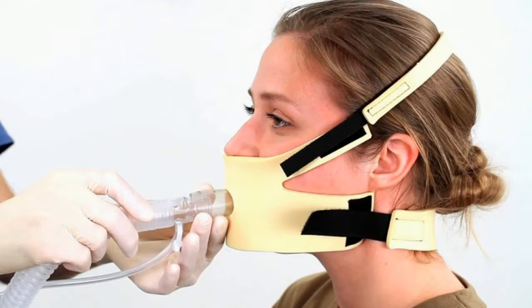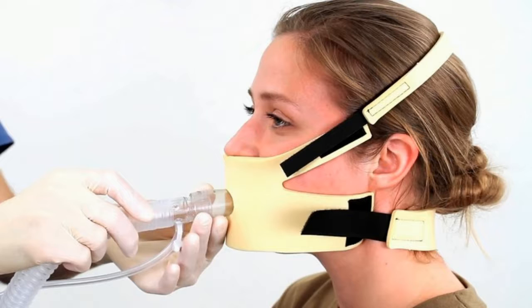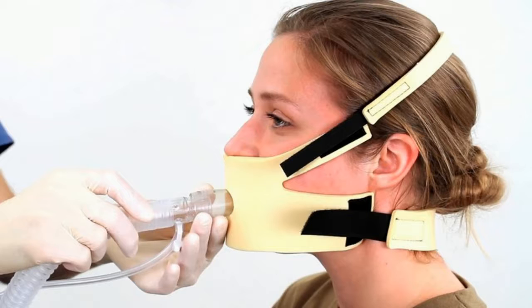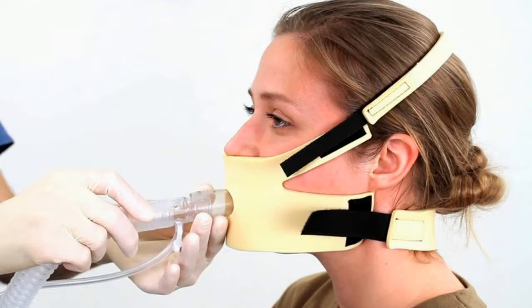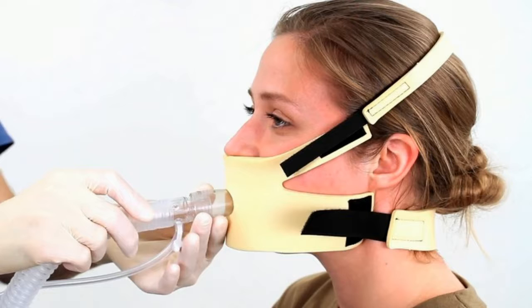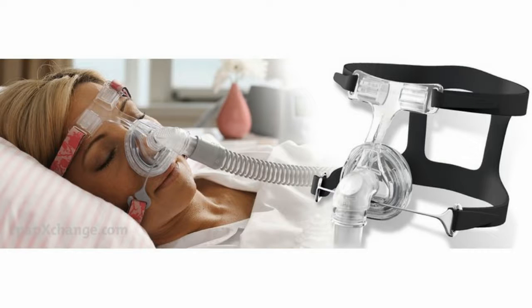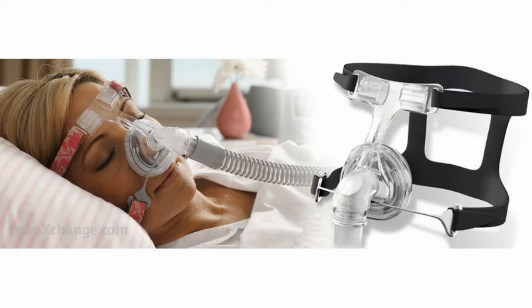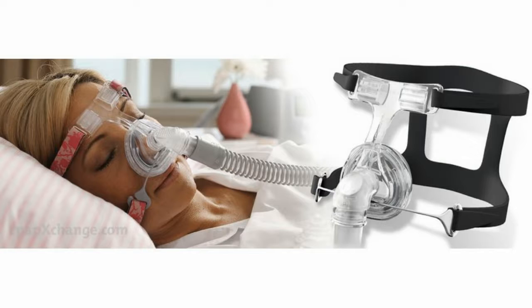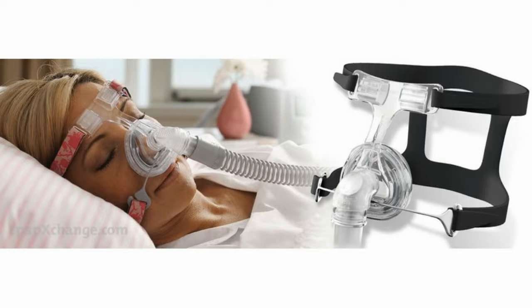Ventilatory support can be provided to patients that have sleep apnea with a wide array of interfaces and ventilatory modes. The Bi-level Positive Airway Pressure, BiPAP, and Continuous Positive Airway Pressure, CPAP, are two common ventilatory modes providing non-invasive ventilation, NIV.